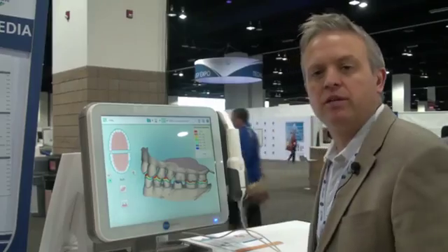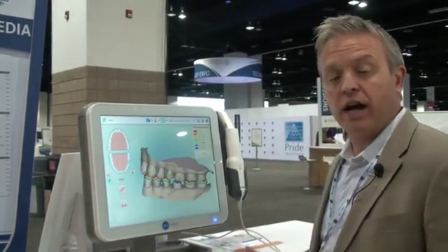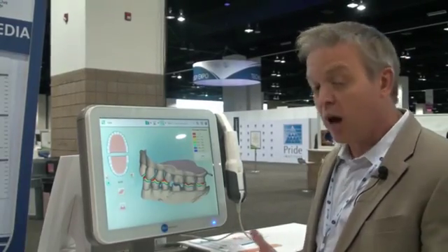Good morning, this is Dr. Brett Jacobson again here at the ADA meeting in Denver, Colorado. We're here at the iTero booth. We're doing a lot of demos — yesterday and today we've been doing a lot of those.